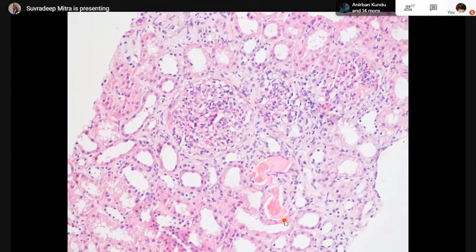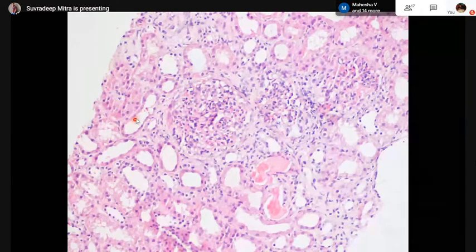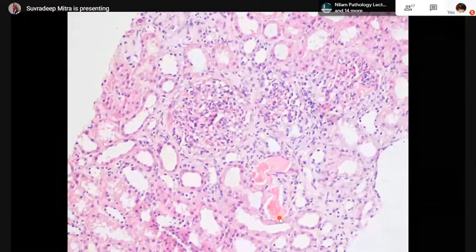So this is the morphology that we can see in low magnification. Concentrate on the glomerular compartment. You can see the glomeruli are quite large and very cellular in this magnification. I showed you the normal morphology, so this glomerulus is way too cellular. Also, please look at the tubulo-interstitial compartment. These tubules, you can see that the lining is quite flattened. And note these tubules which are containing some pigment casts within them. That is the evidence that hematuria was there.